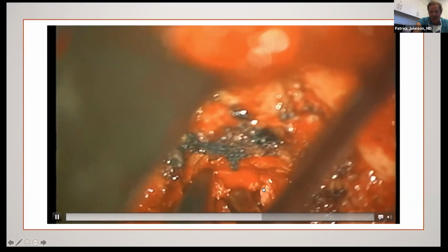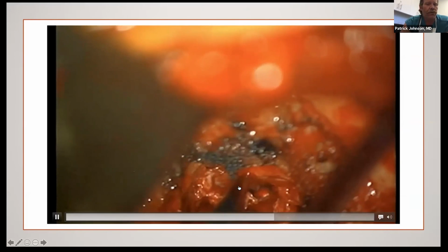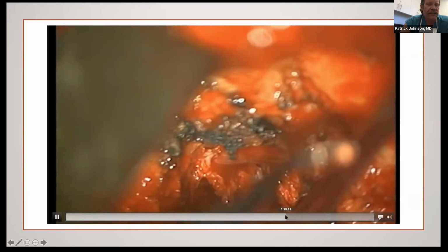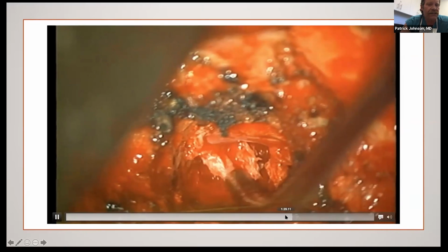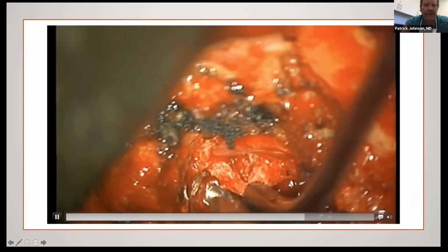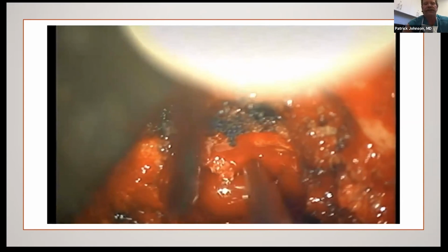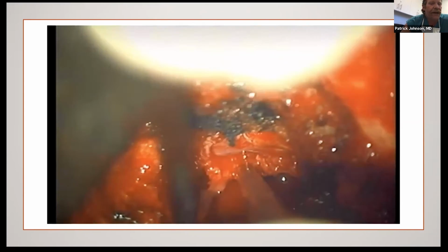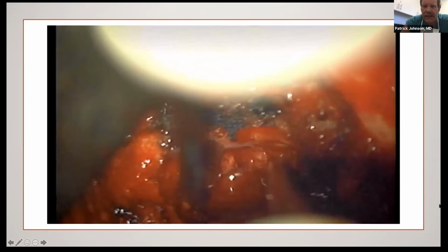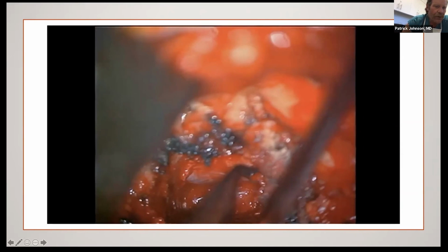This is actually a fairly soft tumor. Many of these are calcific. We end up having to drill the whole thing out, and some of them are soft. So it's interesting that the CT scanning does not necessarily tell us the consistency of these lesions until we get there. There are some of them that look like they're completely calcified and look like they're going to need to be drilled out, and some of them are fairly soft, and there's enough calcification within them that they look like they should be densely calcific disc lesions. So anyway, we'll keep going.